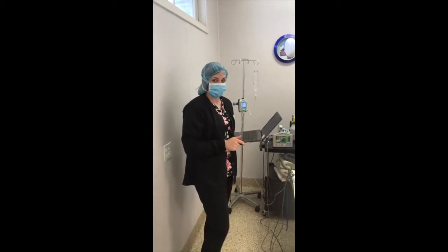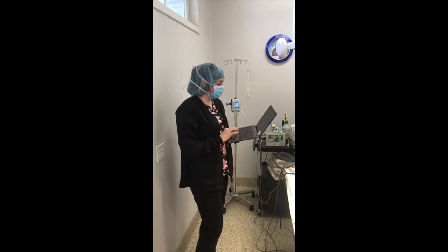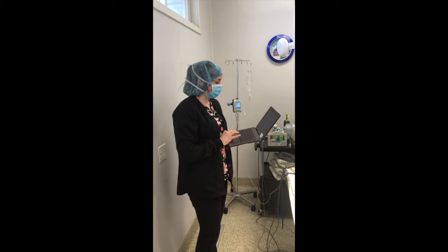She's a feline spay for today. I'm going to go ahead and take some monitoring numbers for her. So I'm going to go ahead and do that right now.